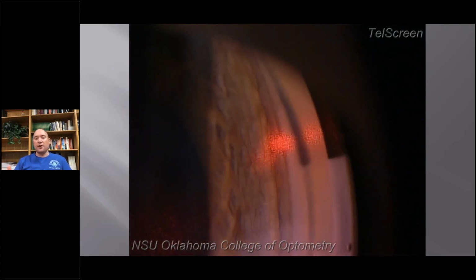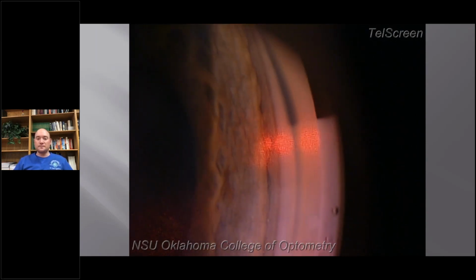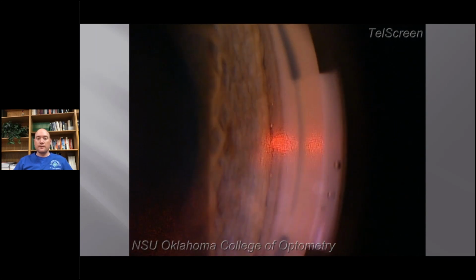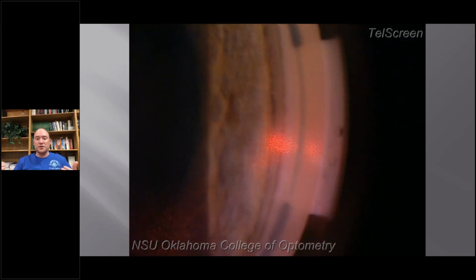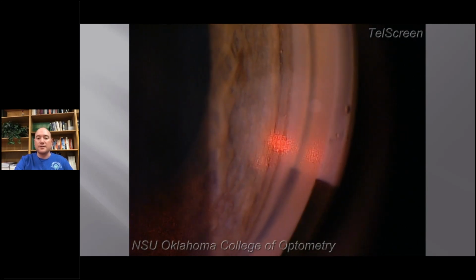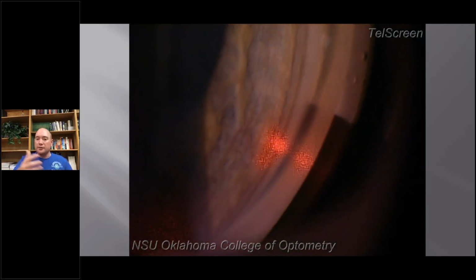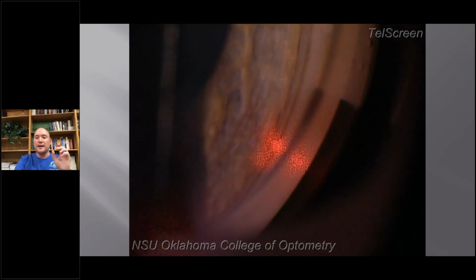And again, if we started at 9 o'clock, we are approaching 3 o'clock right there. So we should be approximately 50 shots, give or take, 5 or 10 either direction. And you continue along. Notice we've rotated the mirror 3, 4, 5 times at this point. That was with the Latina lens. Here is a video with the rapid SLT lens. And just giving you an idea, there's a nice view.